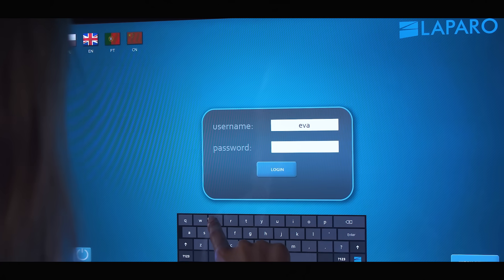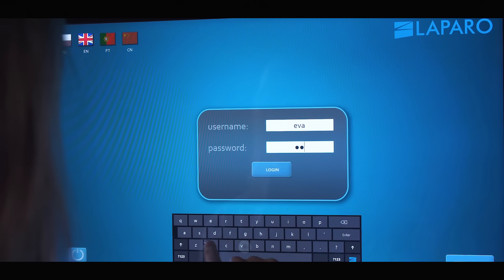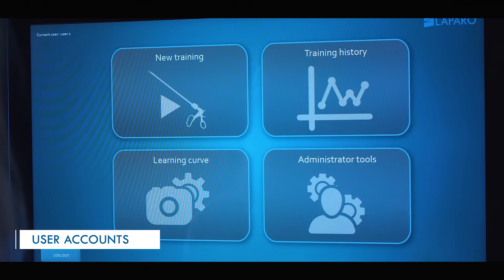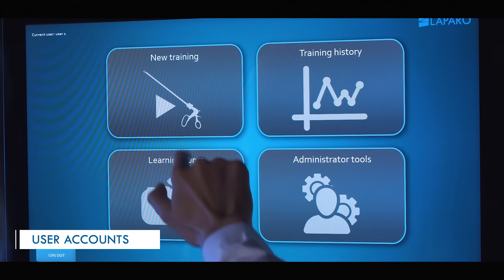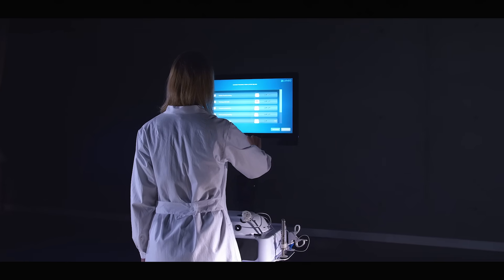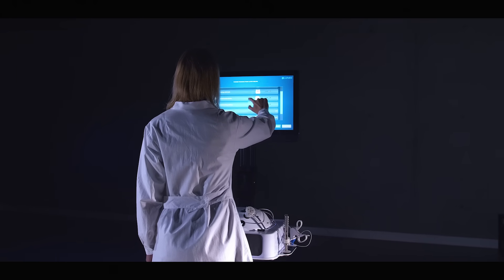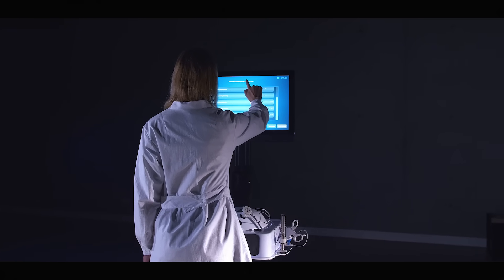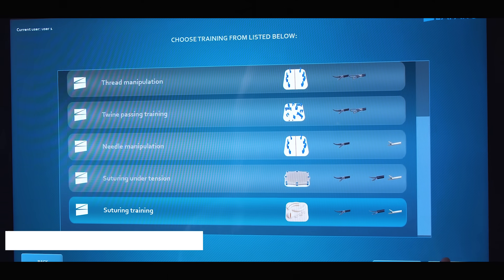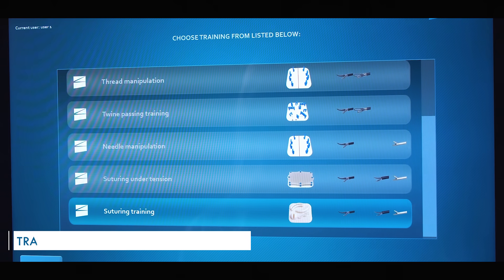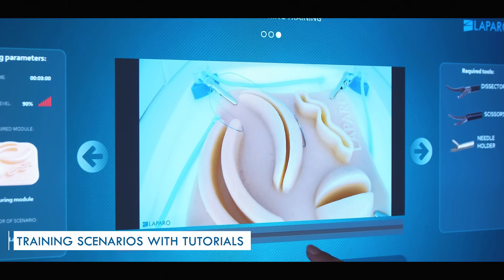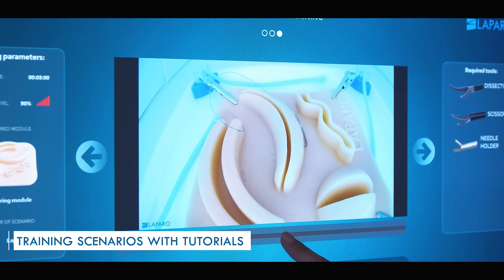LaparoAnalytic is a professional training device with unique software and hardware. Each user has their own account with training history. The software includes a number of training scenarios with tutorials. In addition, the instructor can create their own scenarios.